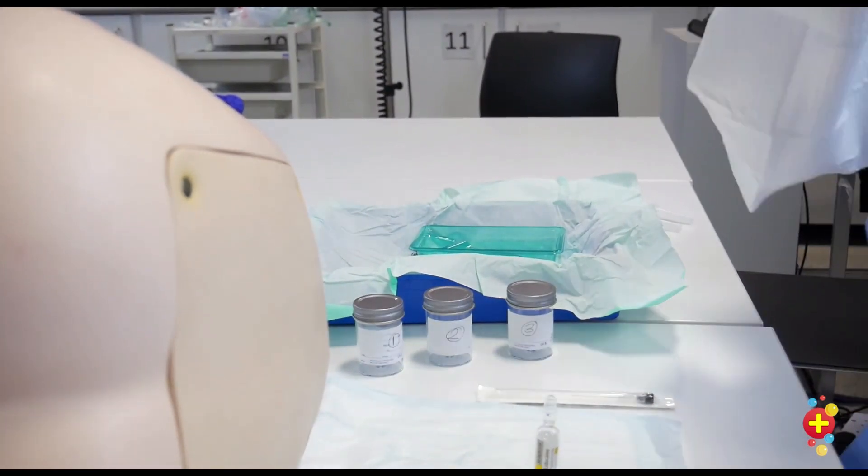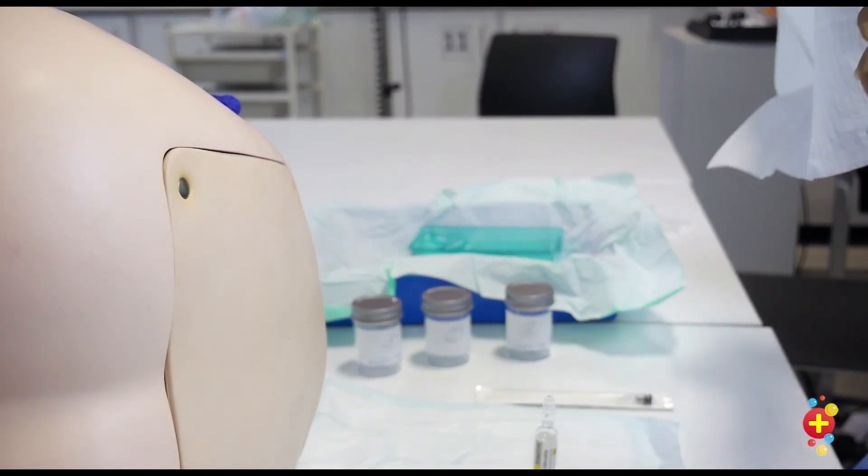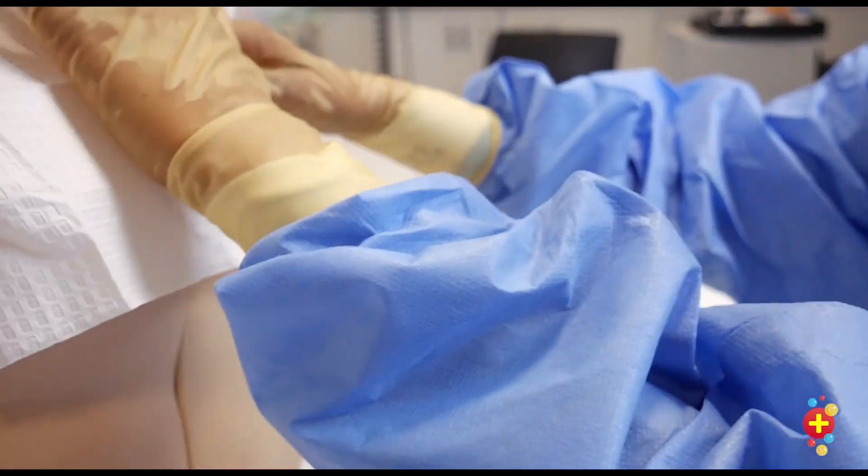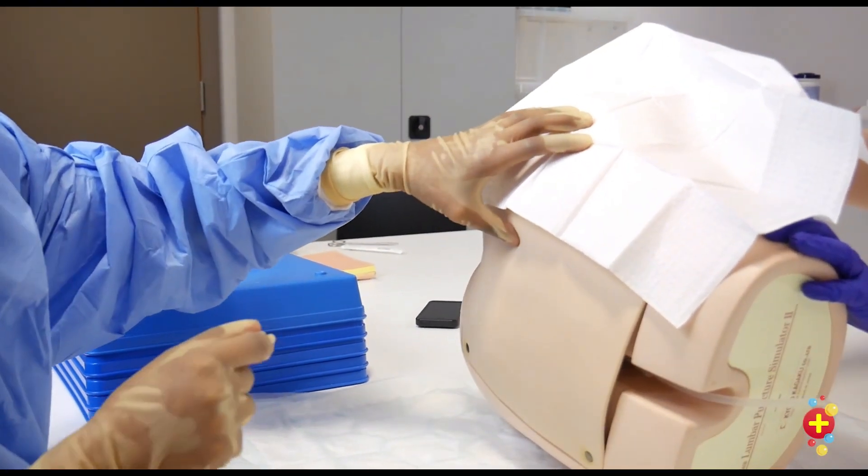You can apply a fenestrated drape or use a drape as a sterile drape on top to allow for hand positioning. Feeling the landmarks again.